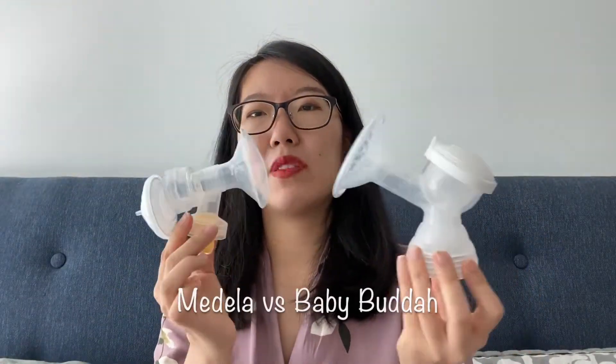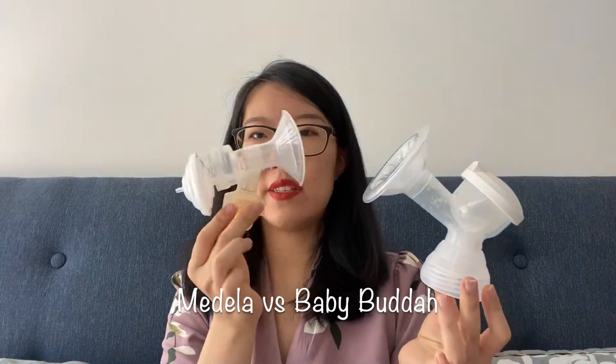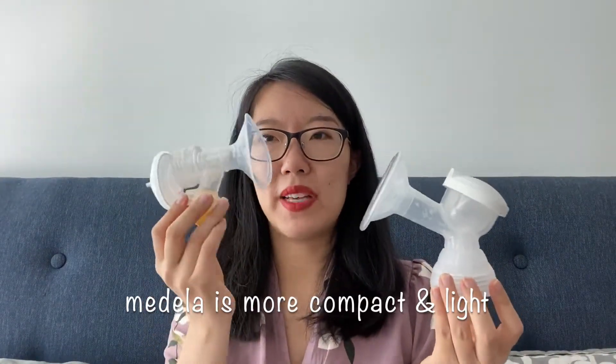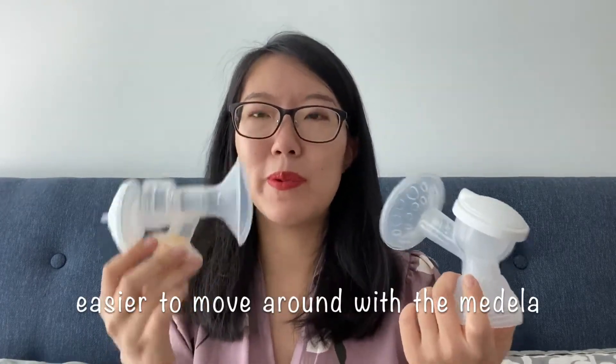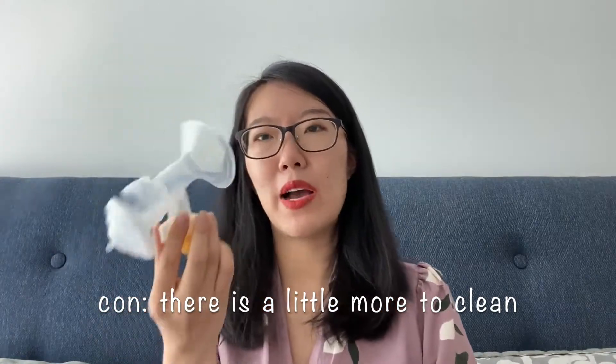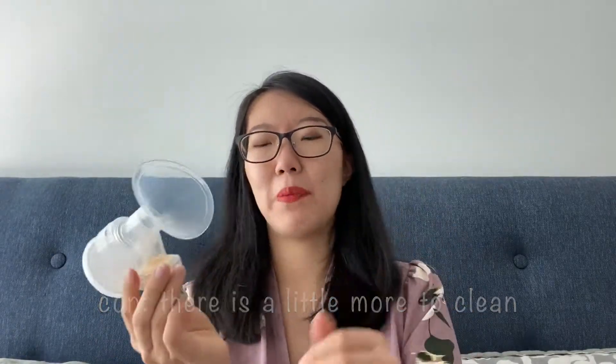In comparison, the Medela and Baby Buddha pump accessory — you can see the Medela is a lot more compact and a lot lighter than the pump accessory that Baby Buddha comes with. There is a difference when I put it on — it's a little bit easier to move around with Medela. With the extra backflow protector there are more parts to clean, but overall I do prefer Medela because it's more compact.